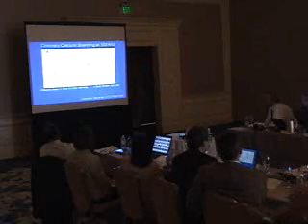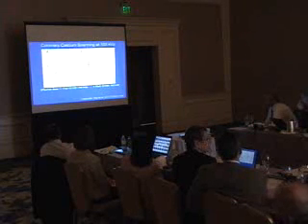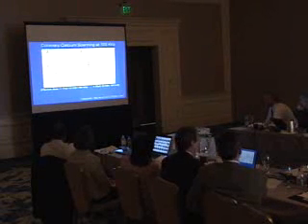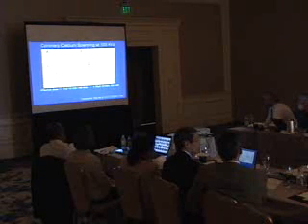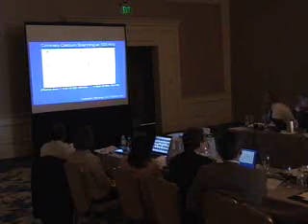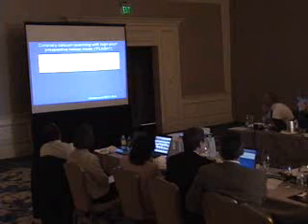We published a study in which we demonstrated that we could reduce using this 100 kVp approach instead of the previous approach. We could reduce again by about 40% the radiation burden associated with calcium scanning, and our dose got down to 1.2 in this study. This did not use iterative reconstruction, and it did not use special windowing of the field of view that has now been applied within the MESA trial.